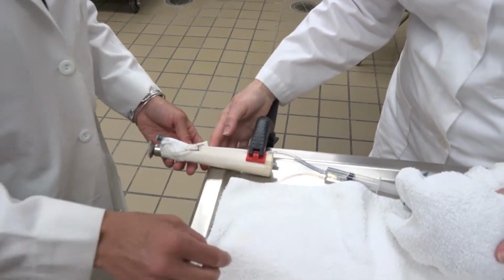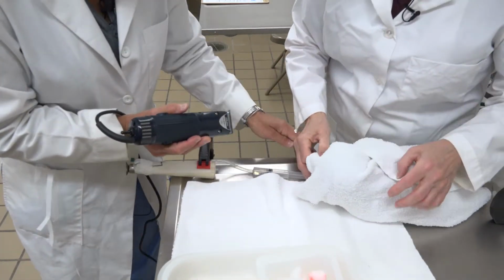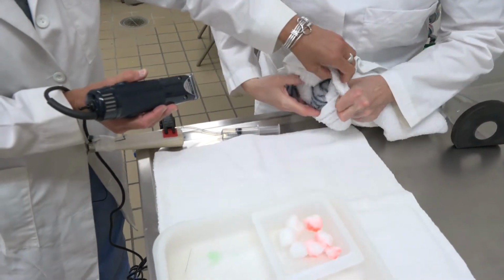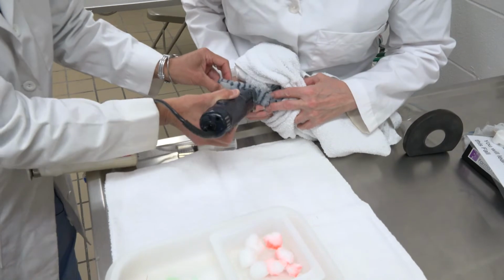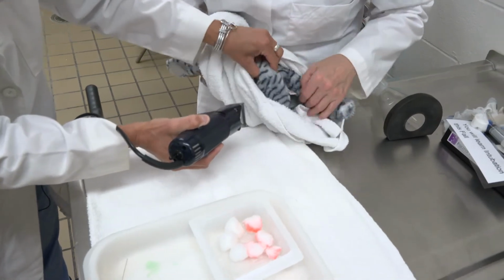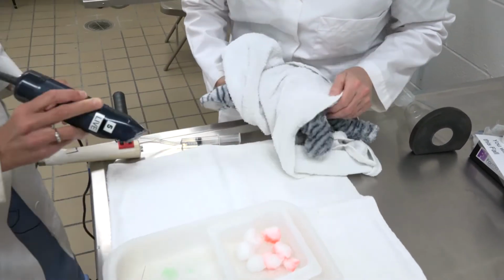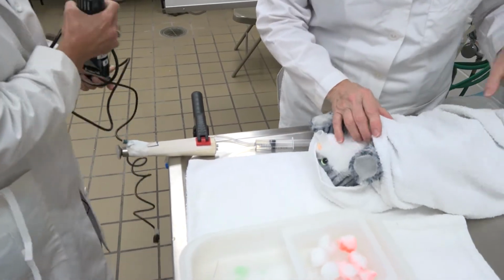And I'm also going to shave for the Doppler. We're going to do that on the other foot and a rear leg as well. I like to do a few places. If one place doesn't work, we have options. Oops, that's the tail. There we go. So a couple of shave spots for the Doppler. Now we're going to intubate.